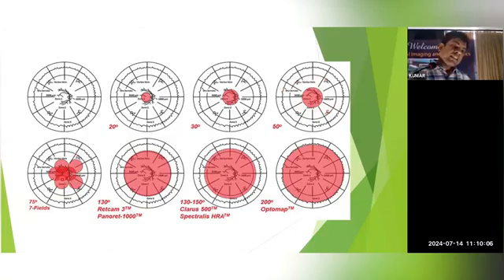This was the DRS study, which tried 7-field images, and it could cover up to 75 degrees. Then we have the RetCam, which can cover up to 130 degrees. The Clarus can go up to 130 to 150 degrees, and Optomap currently has the highest field of capture in a single click, which is up to 200 degrees.